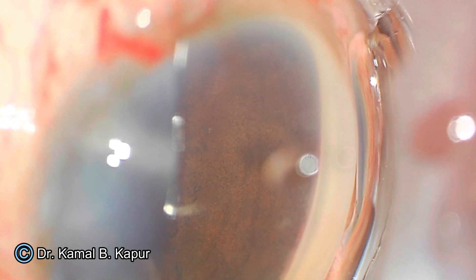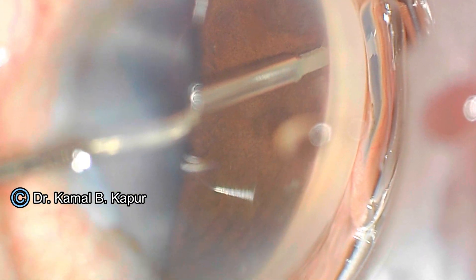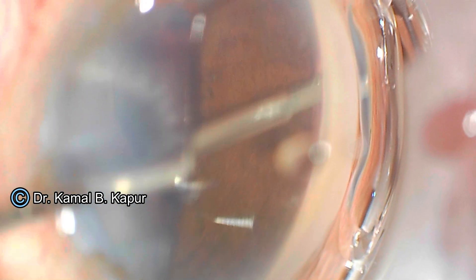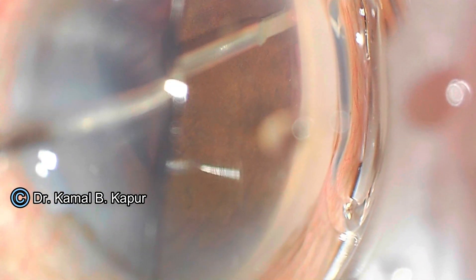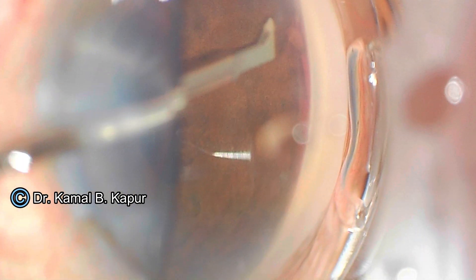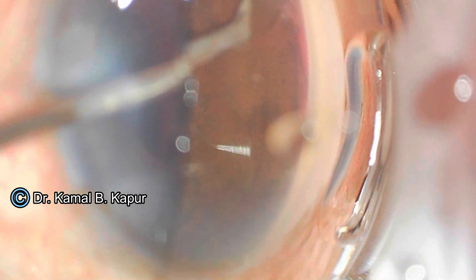Once the view is confirmed, you can zoom out to get a better view of the entry point through the side port, or proceed at the same zoom. With the plate of the KDB blade running parallel to the trabecular meshwork and slight pressure, perform the sweeping movement — achieving complete shaving of the trabecular meshwork. Be very careful: a posterior attack can cause iridodialysis.